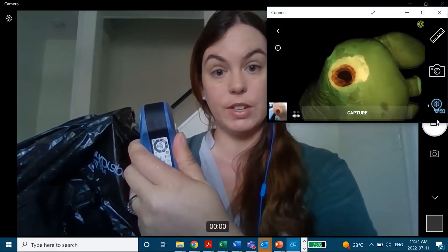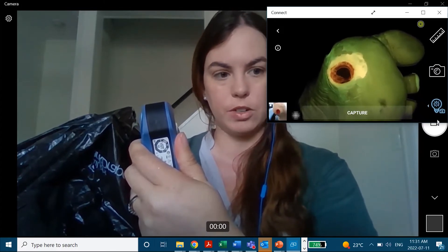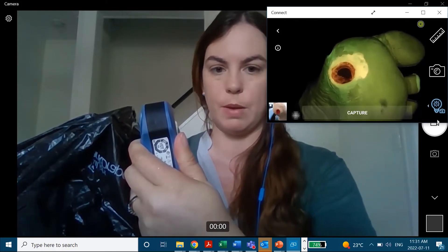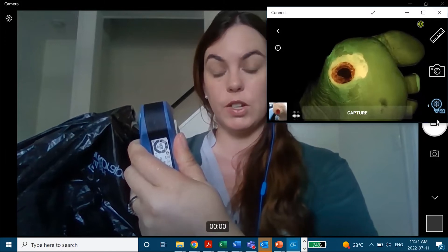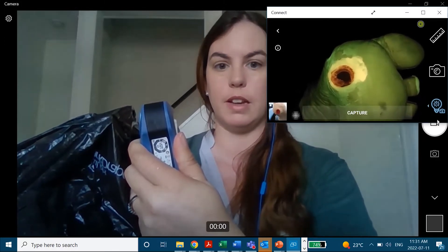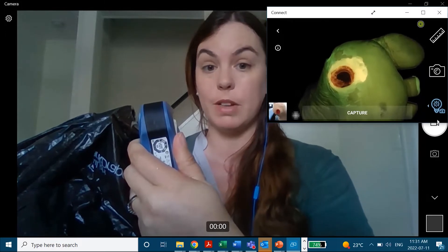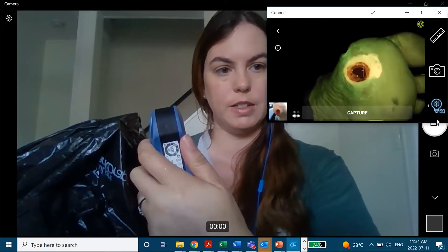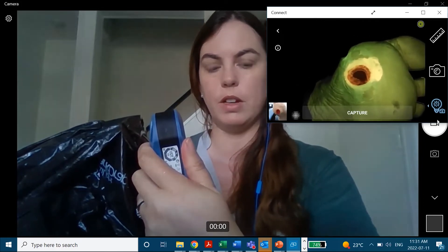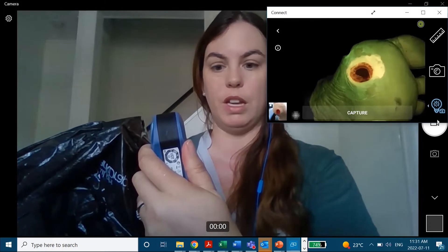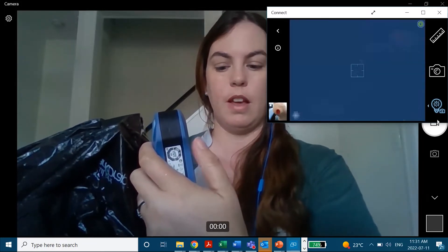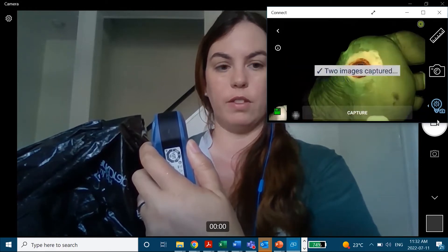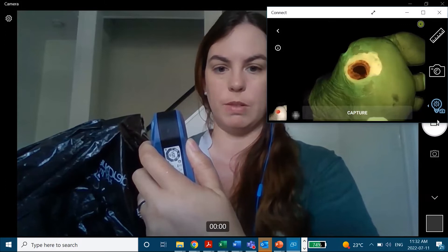I have one of our newest features on the device enabled — co-registration — shown with the light bulb with the one and the little camera beside it with the two. With this feature, I'm able to capture fluorescence and standard images at the same time with one click of the button. I'm going to get to the right distance — I want to be 8 to 12 centimeters from the wound, as indicated by that green rangefinder at the top — and then click capture. I'm going to hold it steady while it captures both the standard and fluorescence image. And now my two images are captured.